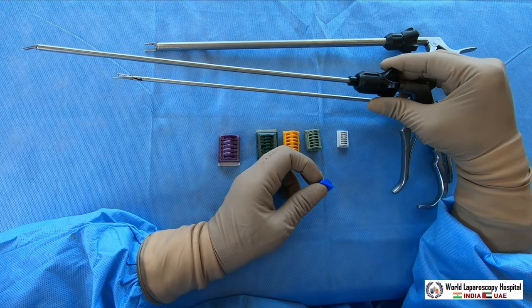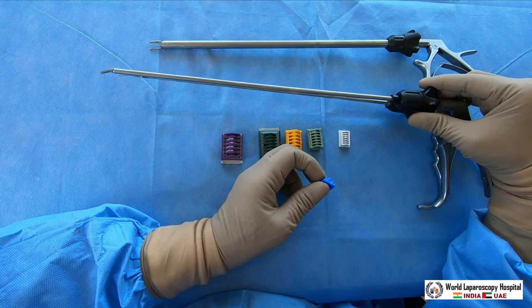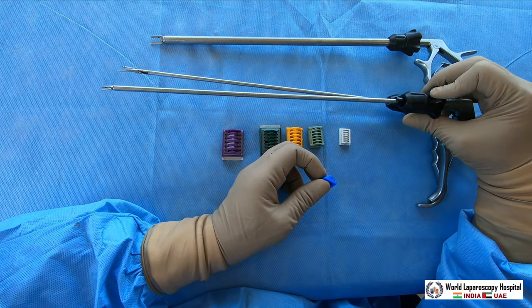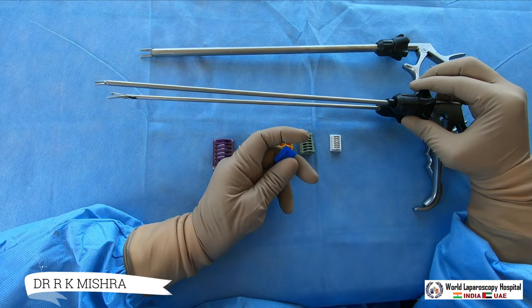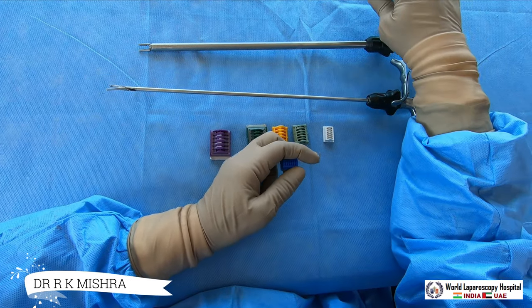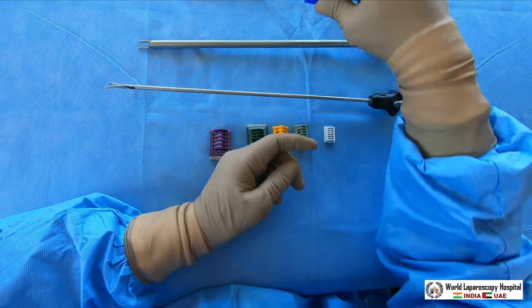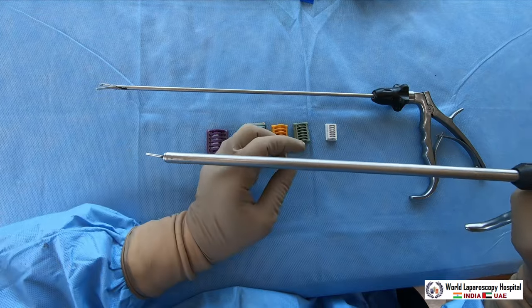This is a 5 mm clip applicator but it is rarely used. Do you know why? Because structures up to 3 mm — which is the range for the blue cartridge — can be safely coagulated by monopolar or bipolar energy. So generally the blue one we don't use. The maximum-use clip applicator is the green one, the medium-large size.